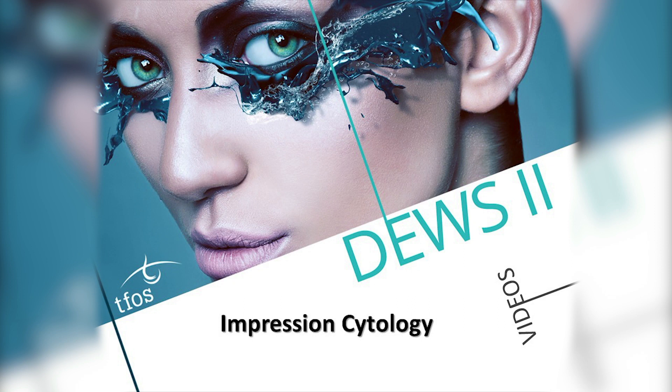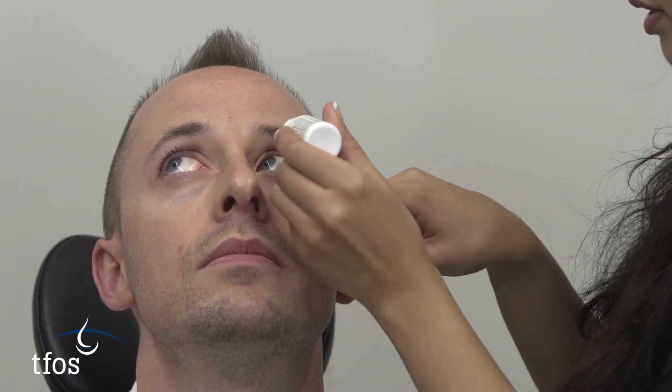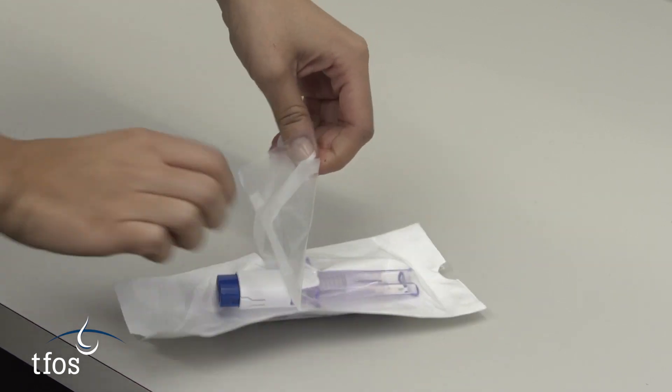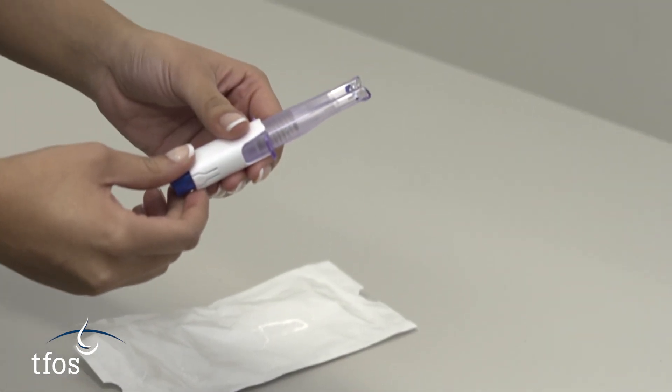Impression cytology is used to collect a sample of superficial epithelial cells from the ocular surface for laboratory analysis. Topical anaesthesia is required prior to conducting impression cytology. Samples are usually collected using filter paper pressed against the bulbar conjunctiva. However, individual sterile single-use sample collectors provide a straightforward option for undertaking impression cytology in clinical practice.